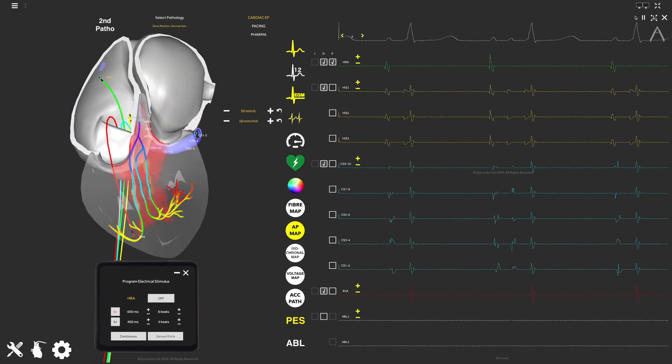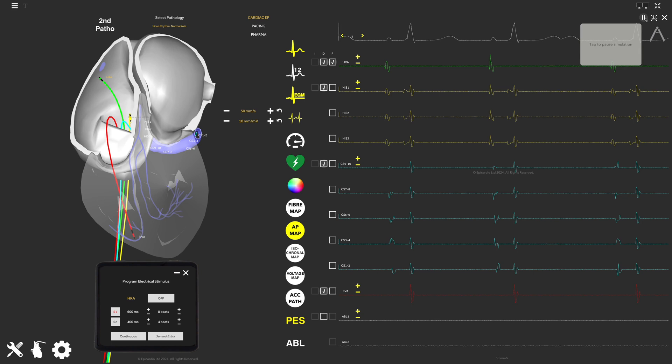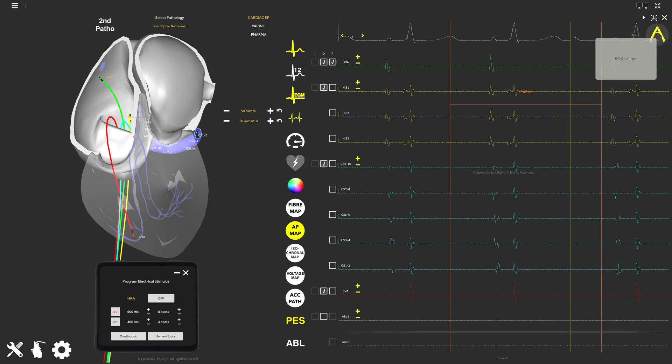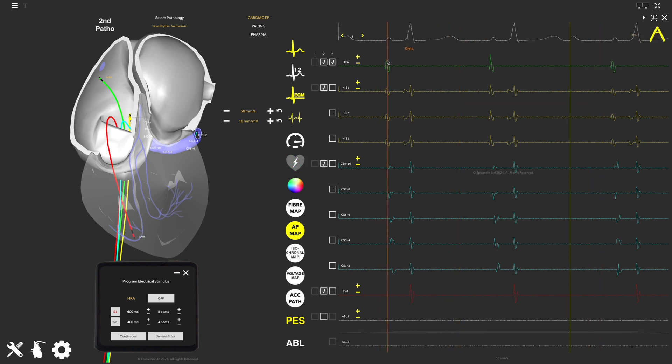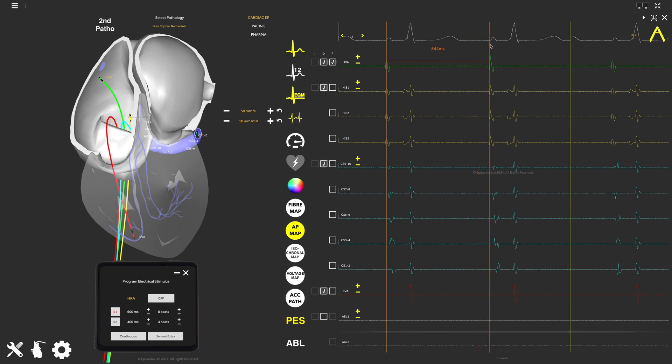Click here to pause the simulation and use the caliper tool to measure distances on the EGM signals. For example, the length of the current heartbeat cycle.